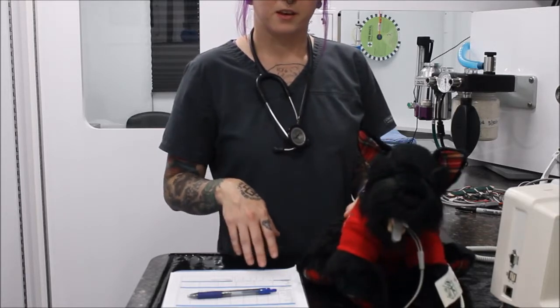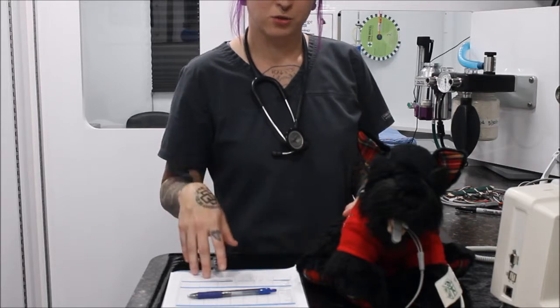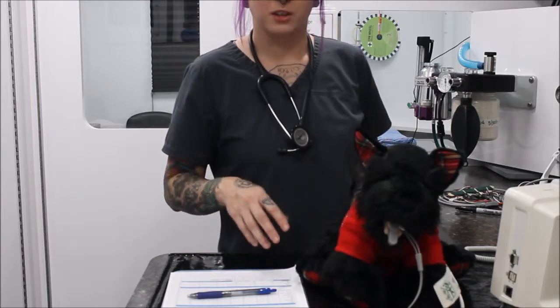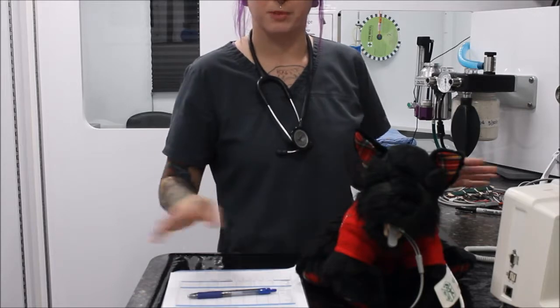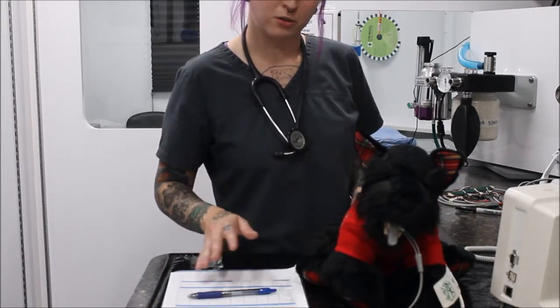Then we've got surgical stage 3, plane 2, which is usually what we call surgical anesthesia. That's usually the ideal time to perform surgery. Heart rate should be normal, respiratory rate should be normal, everything should be kind of evening out and should be good. That's the time for you to do surgery.